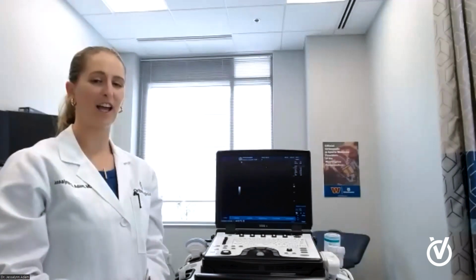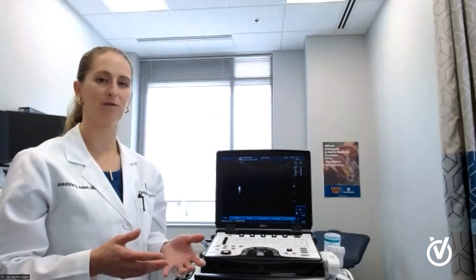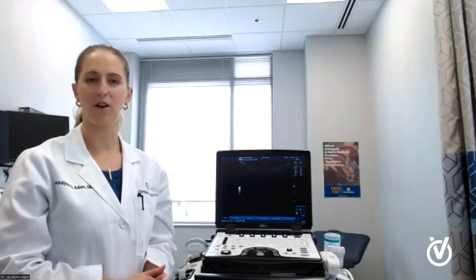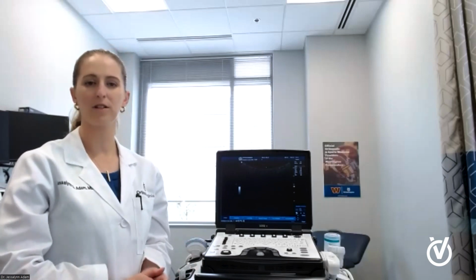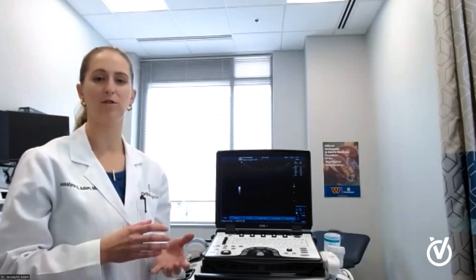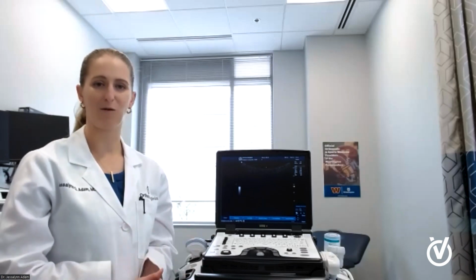So if somebody is having pain, but everything looks okay on an X-ray on their joint, would ultrasound be a good next step? Absolutely. I love to put the ultrasound where it hurts, and you'd be surprised what you'll find. So ultrasound gives you different information than an X-ray. An X-ray is really great at looking at bones, and that's probably where ultrasound is the weakest. So the sound waves do not pass through the bone. So ultrasound can provide different information, and I've found all sorts of things that way.